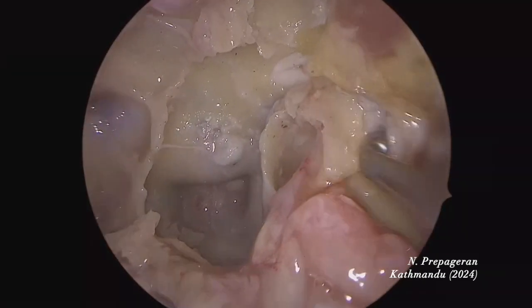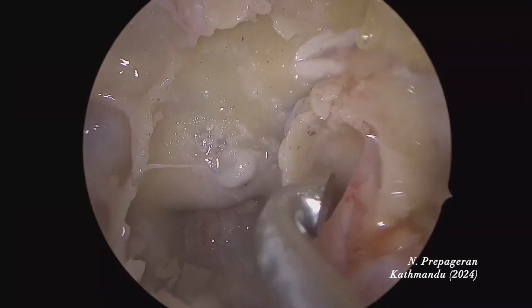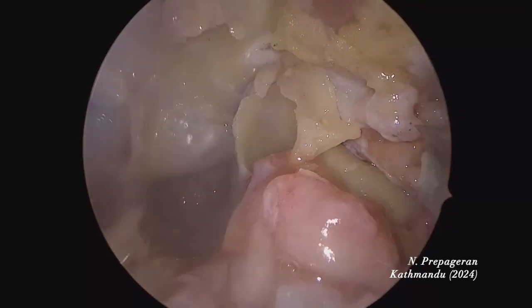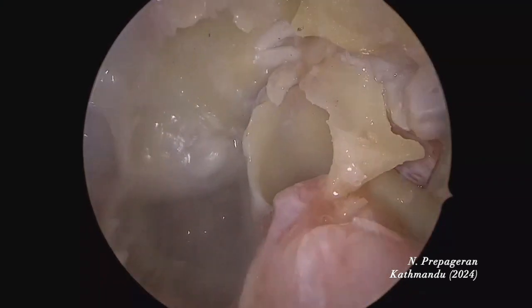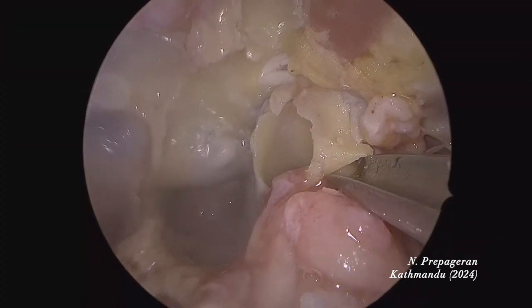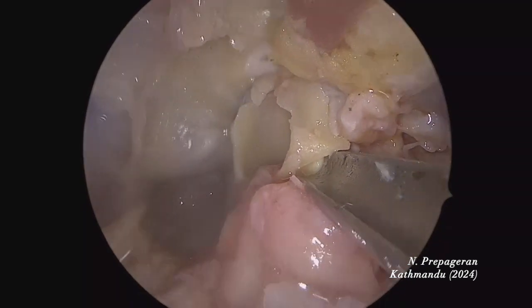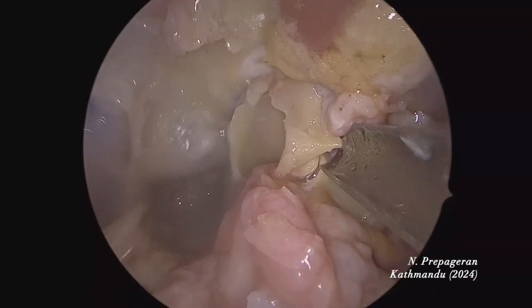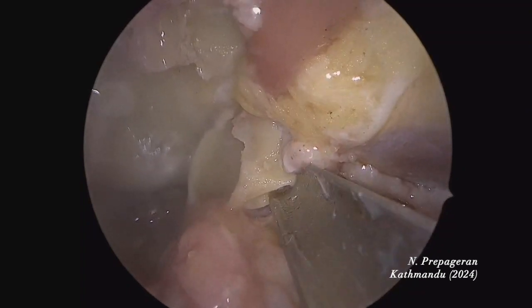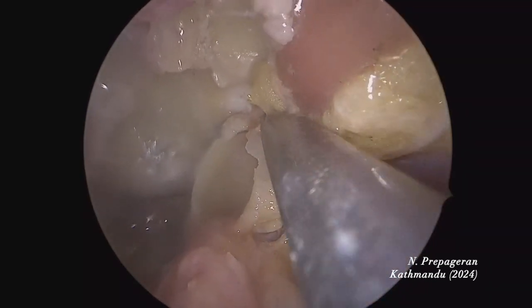Remember foramen rotundum? Foramen rotundum is here — that's V2. Can you see foramen rotundum? Can you see the nerves going in? I'm going to chisel and expose the foramen rotundum a bit more. You just need to chisel at the right spots. If you chisel at the right place, everything opens like a book. I'm removing Meckel's cave area.